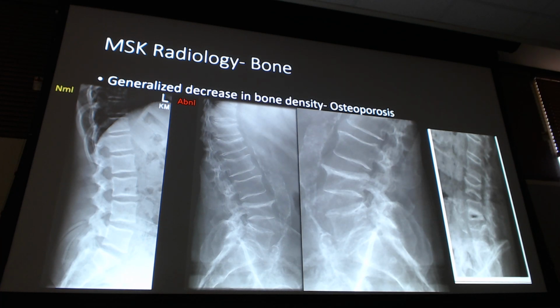Well, I know you can turn it, like you can turn it different. You can, but that's going to be solely related to your x-ray tech and how they do the x-ray. And it's going to be at a level that you guys won't have any control over, and I don't want you to spend brain power on it, right? So just kind of stay on the surface with that, compare like x-ray with like x-ray.